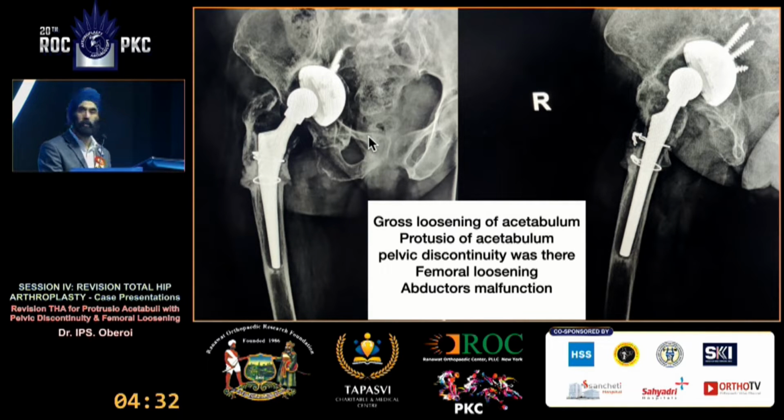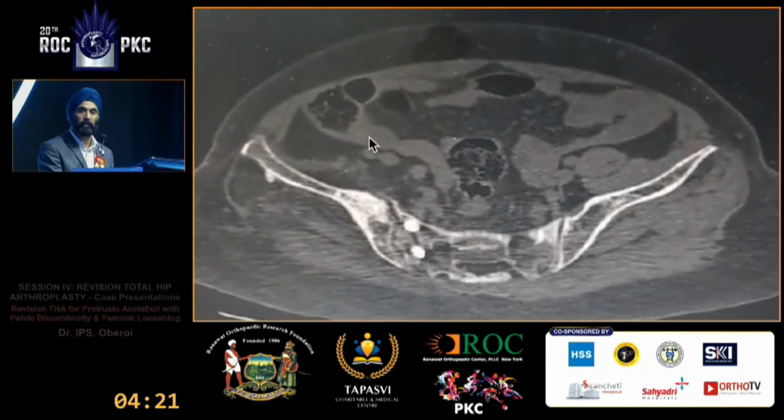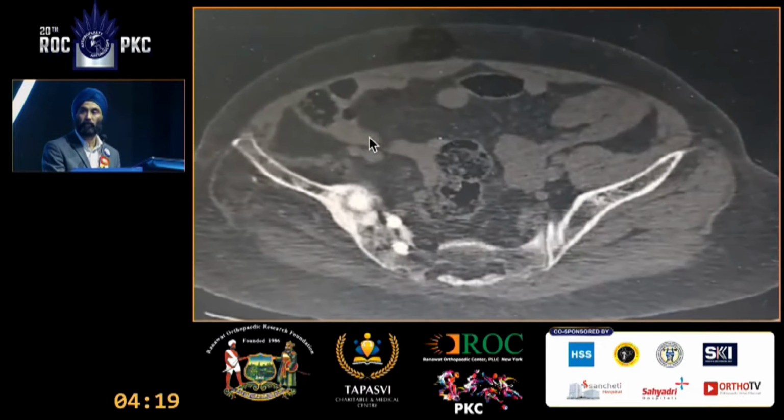Why do you say there's pelvic discontinuity here? There is an impending pelvic discontinuity, I say so. So yeah, I agree with that. The other thing you want to pay attention to is the vessels, because that cup and the screws are going.